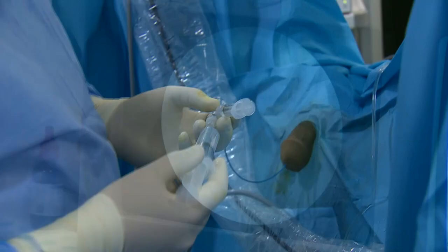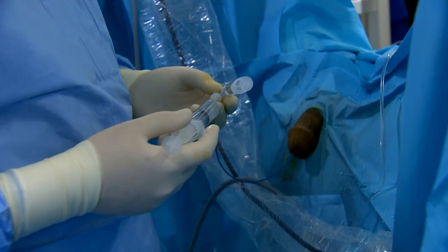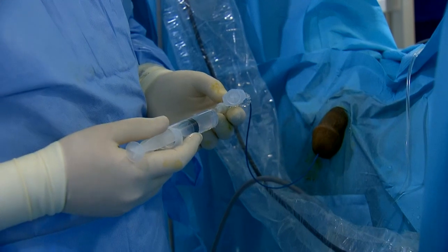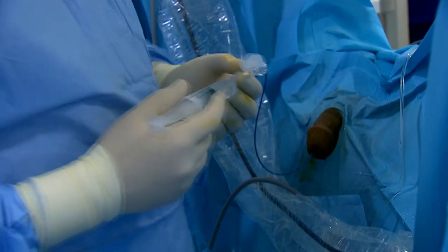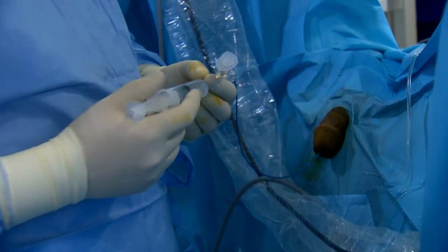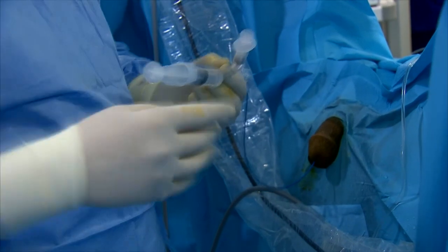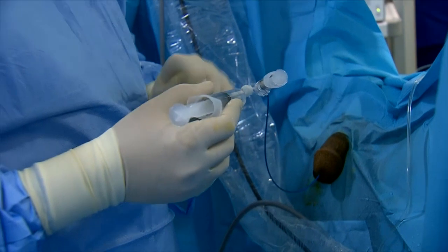But live surgery is good for showing problems and solving problems. Therefore, it's more interesting if the tip of the catheter is not in the correct place. We have a guide wire. Just a moment. Now it is interesting to show because a conventional hydrophilic guide wire also fits to this channel.